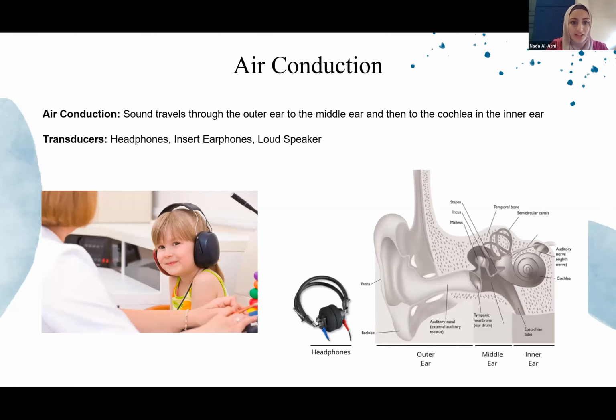So air conduction, as we discussed earlier, is what we are testing when we're using headphones or insert earphones. Sound travels through the outer ear and into the middle ear, so we're past the eardrum and where those three little ossicles, the little bones, sit. And then from there, it goes to the cochlea, which is in the inner ear.